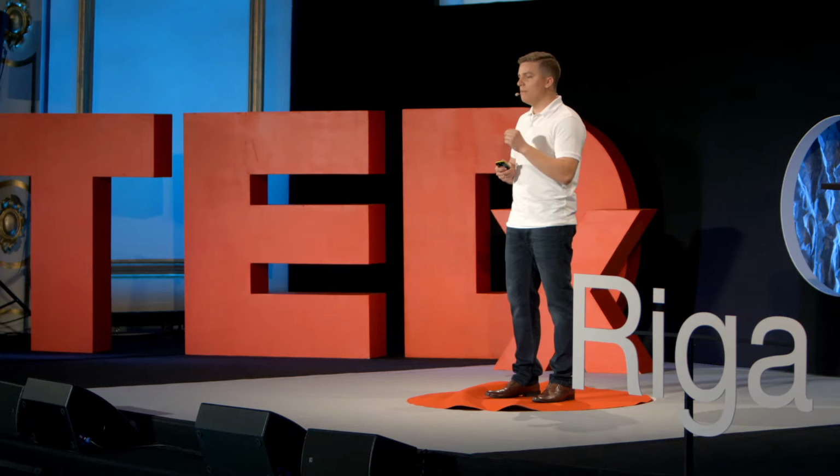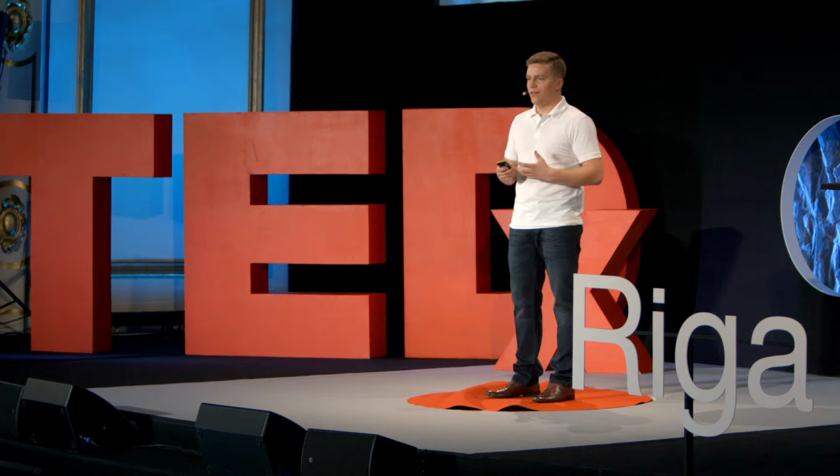What is more, not only my profession, but also my location doesn't matter anymore. It actually doesn't matter whether that's me doing it, because anybody of you could be preparing 3D models and sending them over to any 3D printer in the world. Much like Polina, when she leaves for the Paralympic Games, will be able to take a 3D model of her brace with her, and in case she breaks the back support, she'll just have to find the closest 3D printing shop and make a new one.